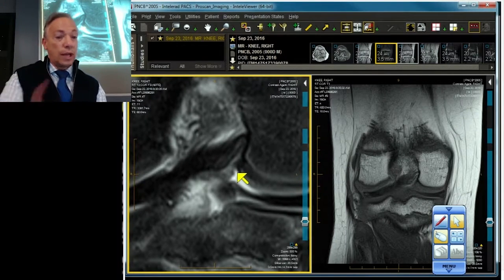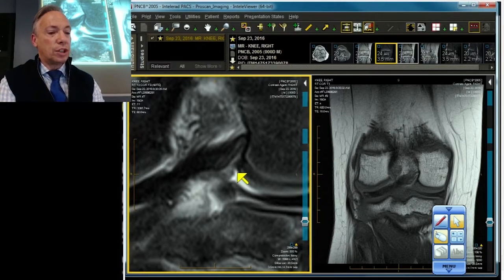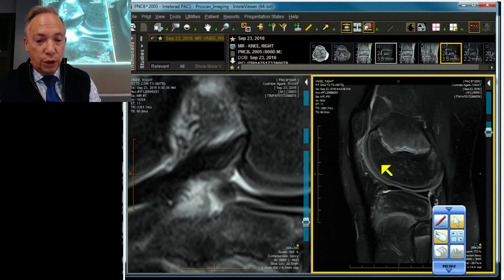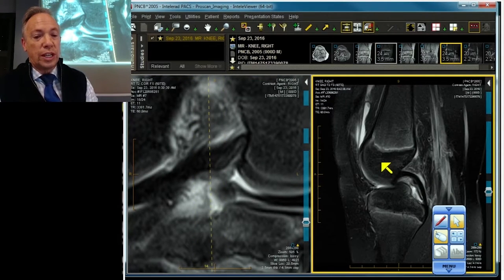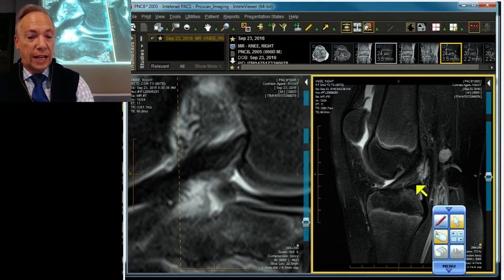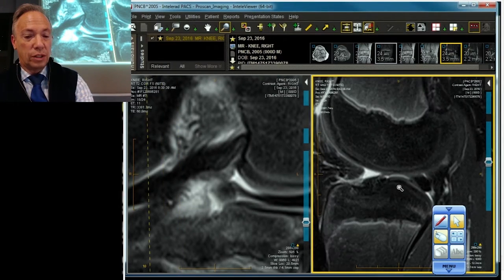So that concludes our discussion of anchoring of the meniscus, by demonstrating in a child detachment of the medial meniscus posterior root ligament. And to add just a little bit of fury to the case, let's make sure we see it sagittally. There's the root ligament on the lateral side, nice and flush. Let me blow it up one more time — nice and flush right there.